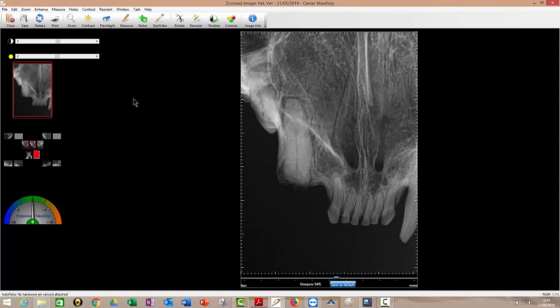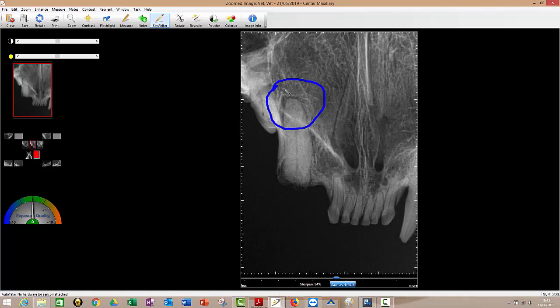I can save this image with the notes on if I want to. So I can do that. Skywriter is just a drawing tool. So I could say to the owner, that's your abscess there if there was one. And again, just right click, erase to get rid of that.